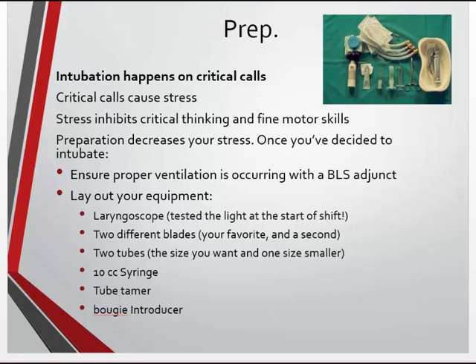You want your 10cc syringe ready to go. You don't want to be looking for that at the last minute. Your tube tamer, and have your Bougie introducer out. So we'll go over that in a couple minutes here, but get that ready. Have it good to go.